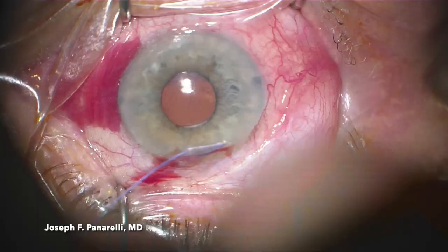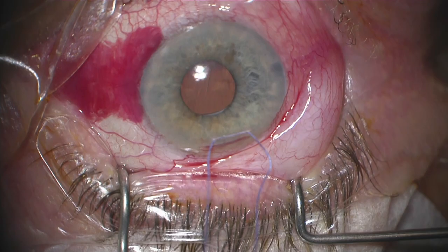Hi, this is Joe Panarelli. I'm going to be discussing Multino III implantation. This is a glaucoma drainage device procedure that I'm going to walk you through the basic steps of.